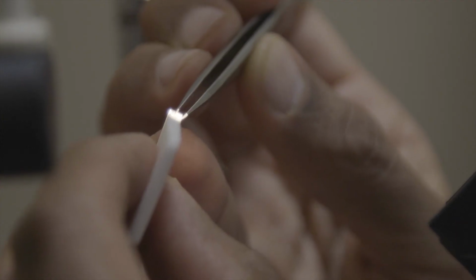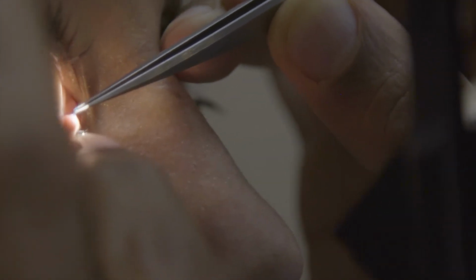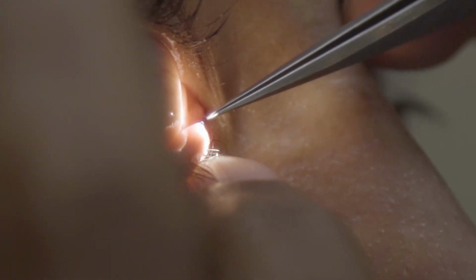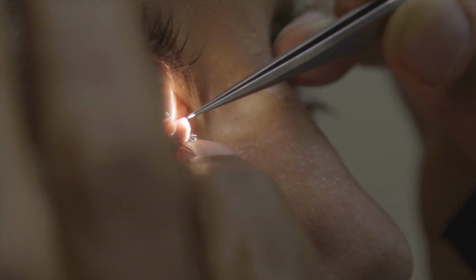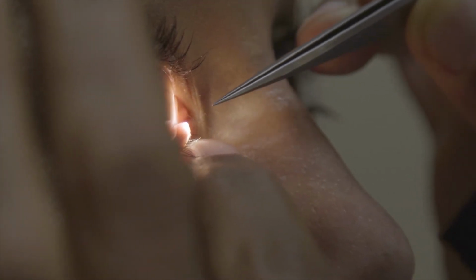That just turns your eye away. See how it goes right in? And I just dunk it in. You don't really want it sticking out because it'll fall out. And that's it. It's done.